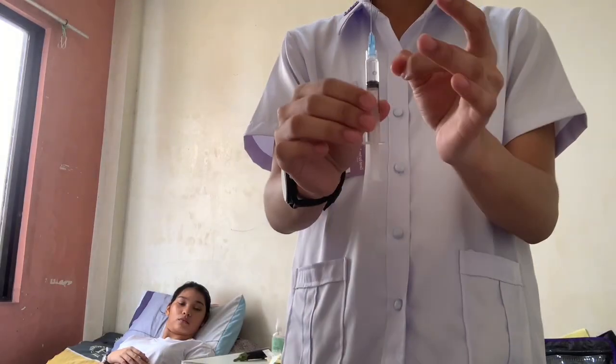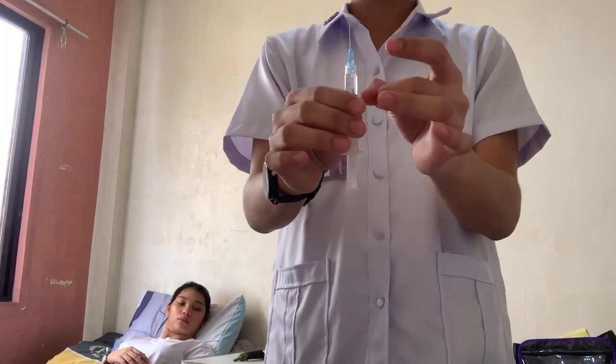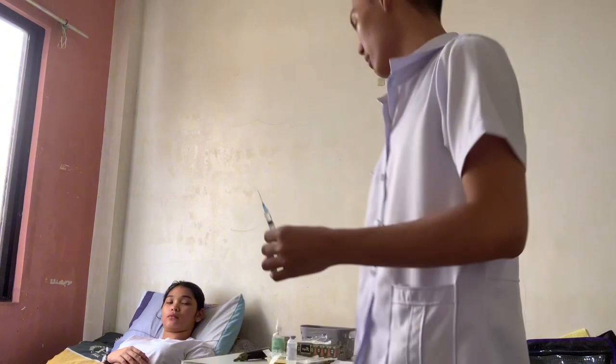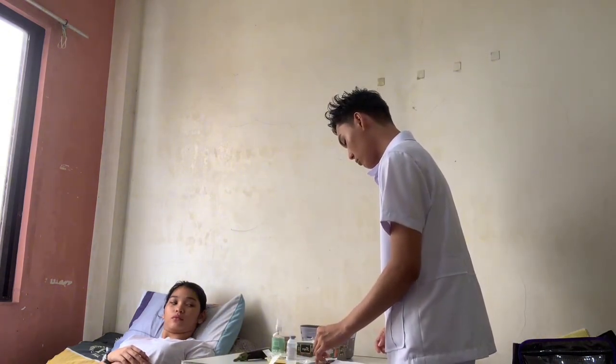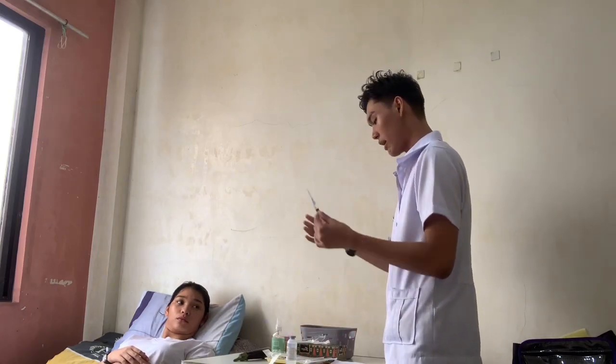If you see any bubbles, then you can just tap the barrel to expel the air bubbles. Since there are no bubbles anymore, then I can cap it. And set it down.